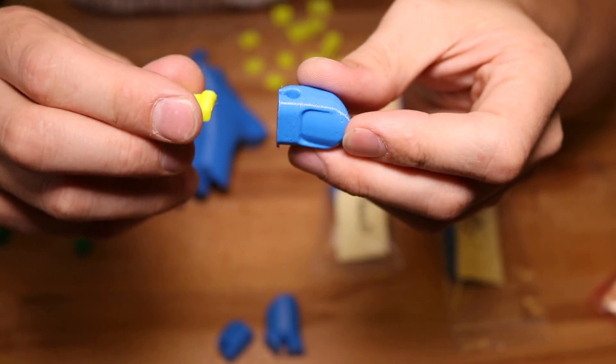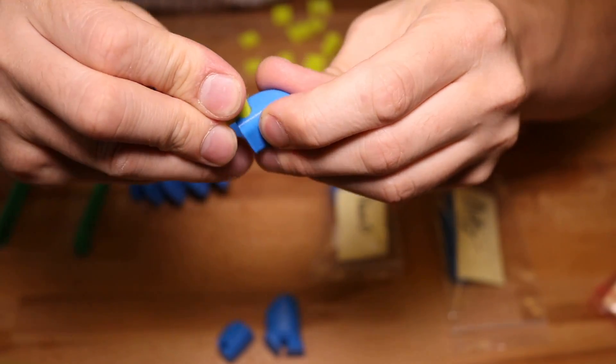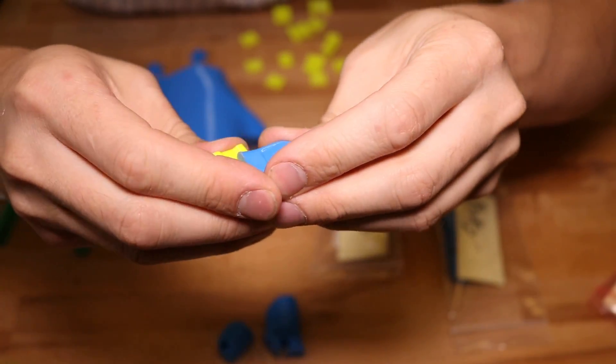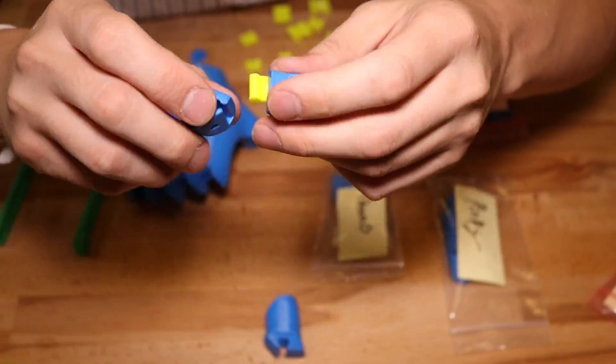The first thing you're going to want to do is use the individual hinges to slide into all the fingers and slowly start assembling the fingers one by one. Once you have one finger assembled, go ahead and repeat the process for all five.